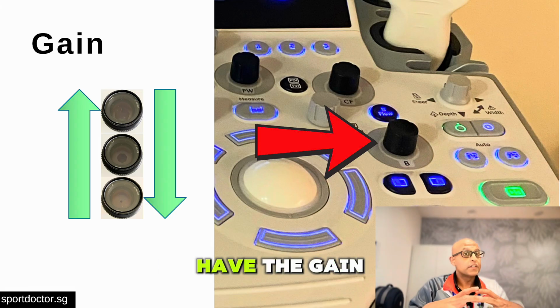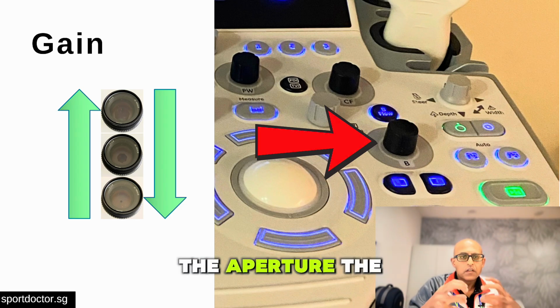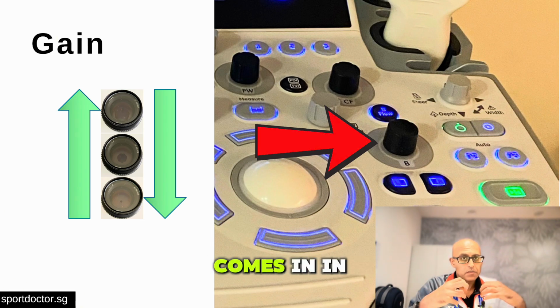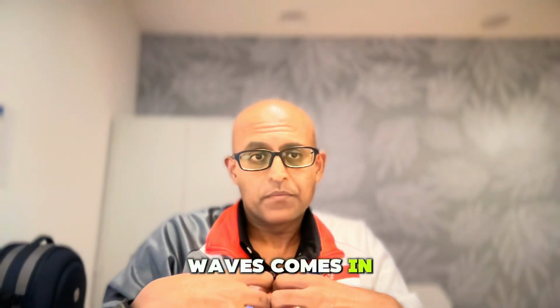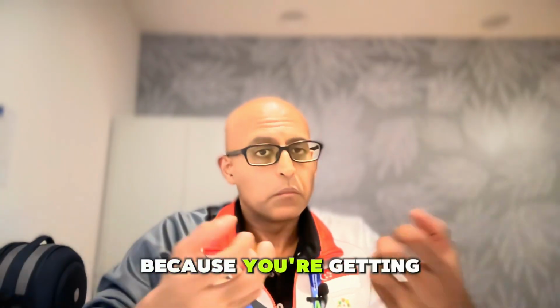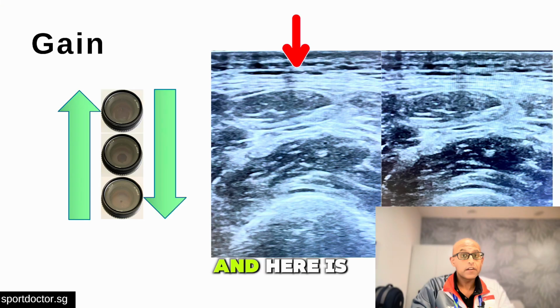Moving forward, we have the gain. Now the gain is a bit like the aperture on a camera. In terms of the aperture, the wider the gain or the bigger the aperture, the more light comes in. In ultrasound, what this means is the higher the gain, the more sound waves come in. And while that might seem a good idea because you're getting more sound waves back, what you'll also be doing is getting a lot more noise. And here is an example.